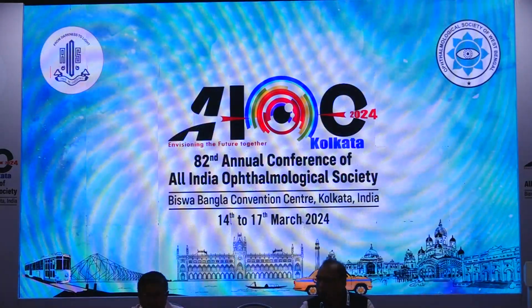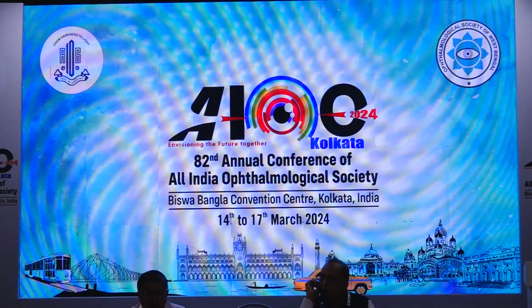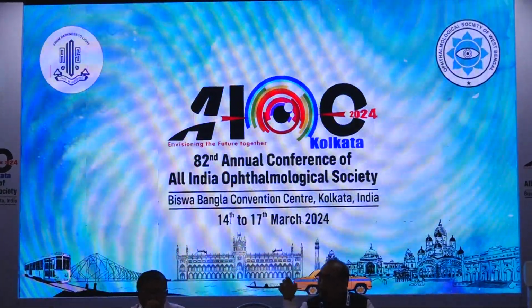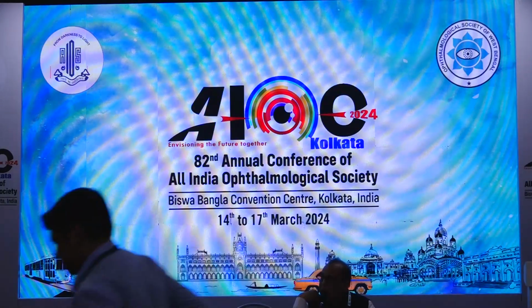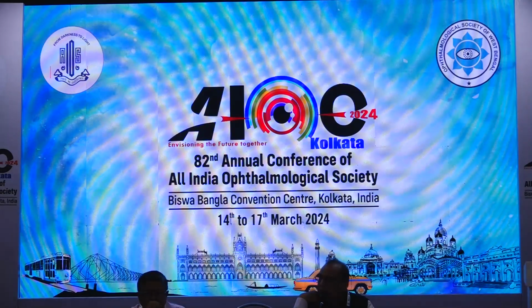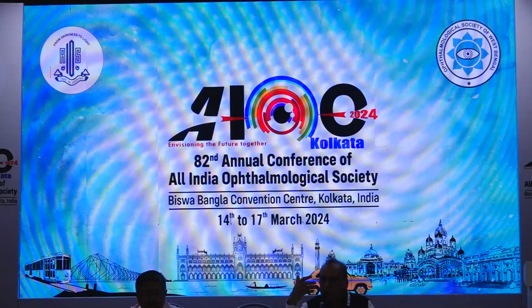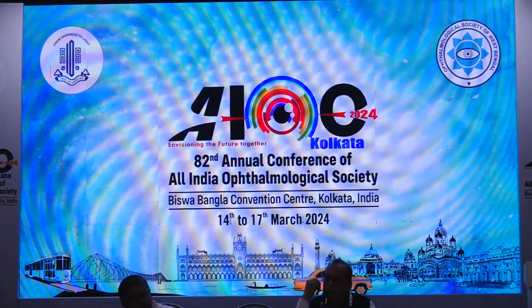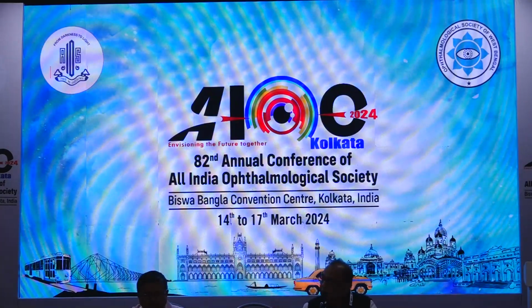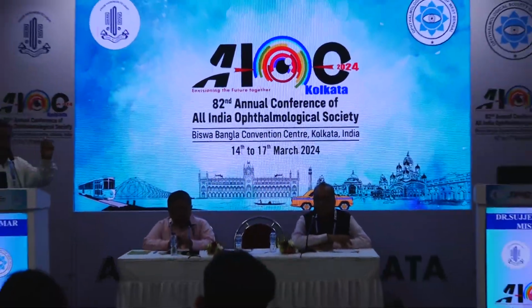Thank you, Dr. Sujeet, for the comprehensive tips that you have given. One thing which always comes to the mind is the cost factor between manual marking and a digital marking system. My experience is manual marking is equally good, and therefore what I advocate is that it should be taken up by every surgeon who is doing a cataract surgery. Absolutely, that is why that should not be a bar, because the margin of error is very, very minimal.